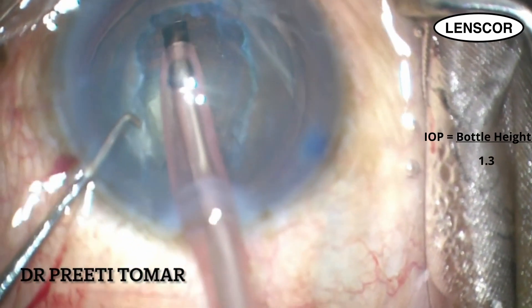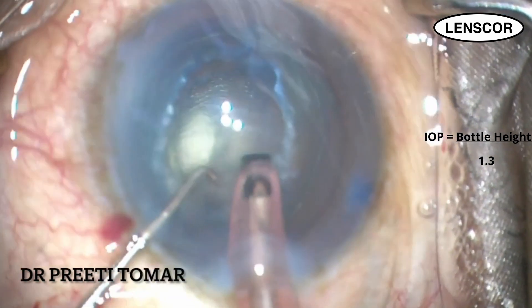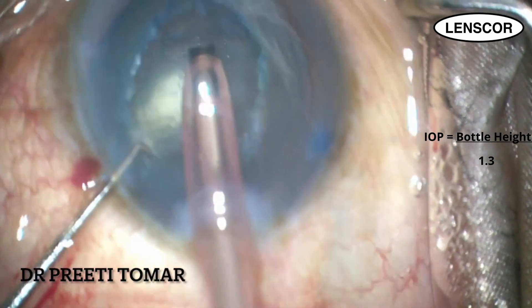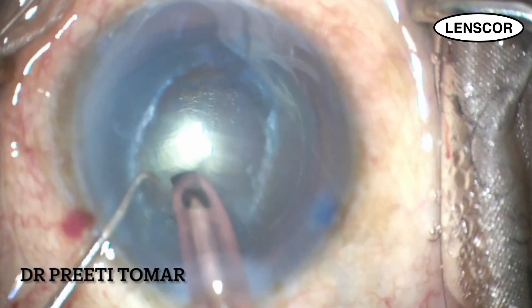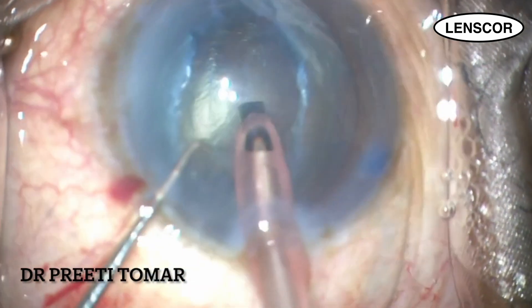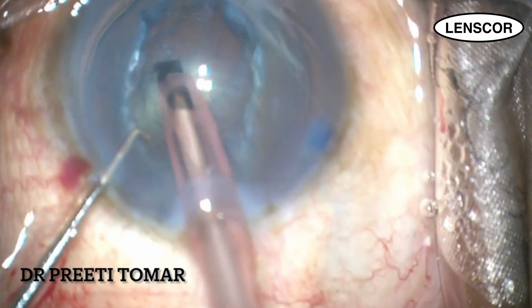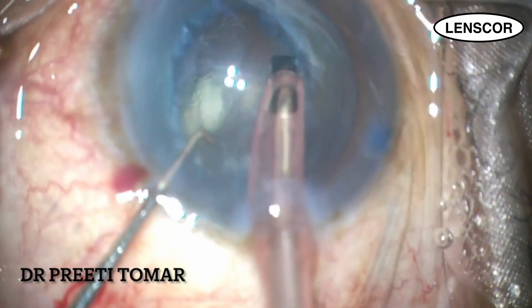Bottle height determines the pressure inside the eye, hence it is kept as low as 45 to 50 centimeters so as to minimize the pressure inside the anterior chamber. The longitudinal power is around 40% in this case, vacuum of about 200 to 300 millimeters of mercury, and aspiration flow rate of 20 ml per minute.